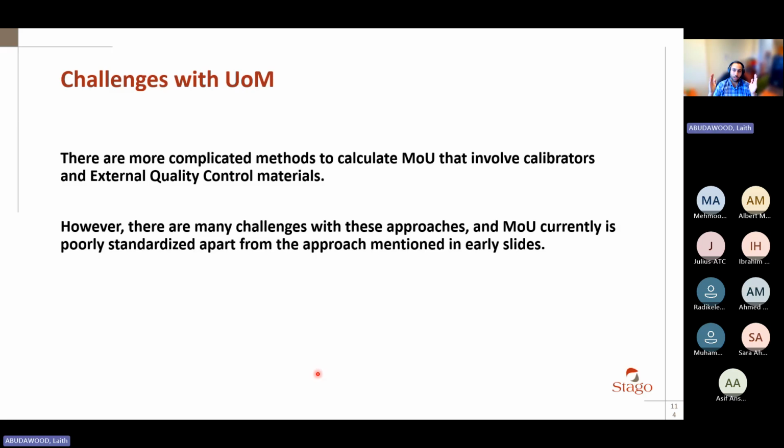So it's very difficult to do. That's why, for example, if my normal QC measures at 100%, my pathological control measures at 20%, what is the uncertainty of measurement at 50% readings? I don't know. I have to get a QC that says 50%, calculate the SD by running it over an entire month, and then I calculate the uncertainty of measurement. So this is one gap with this kind of calculation of measurement of uncertainty, as you can see. Okay, so it's not a perfect approach, but it's one of the approaches available. As long as the customer will ask it of you, then you have to know how to deal with it, okay? Because sometimes it's a requirement of accreditation.